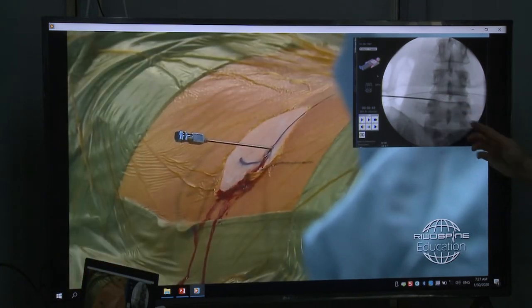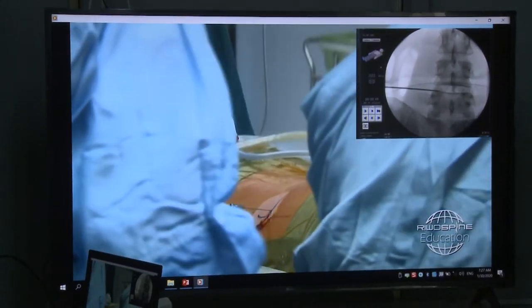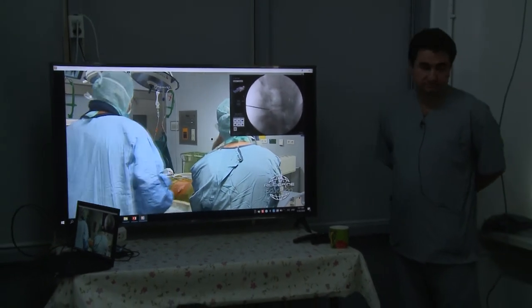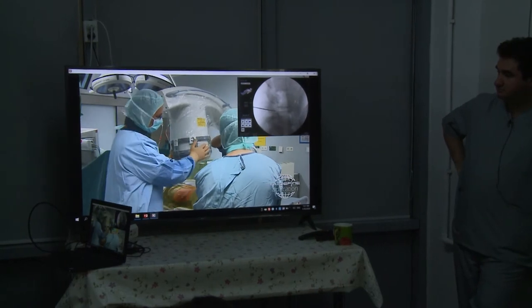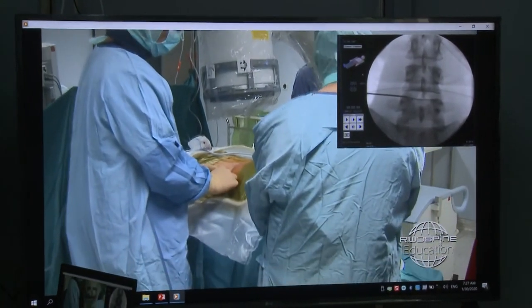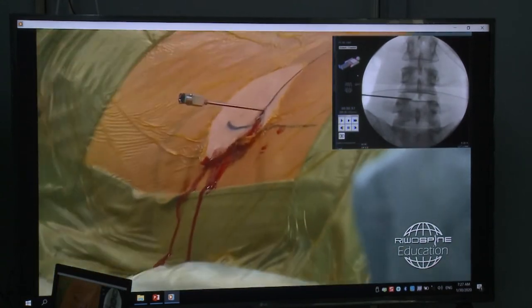And we didn't just pass it, because we don't know the position of the needle now. You go in further when you are entering the spinal canal, okay, and I'm here in the nearly dorsal part of the annulus. This is okay. I feel resistance here already. So 1-2 millimeters more inside, and I'm at the medial pedicle line. So now I feel I'm in the disc here.